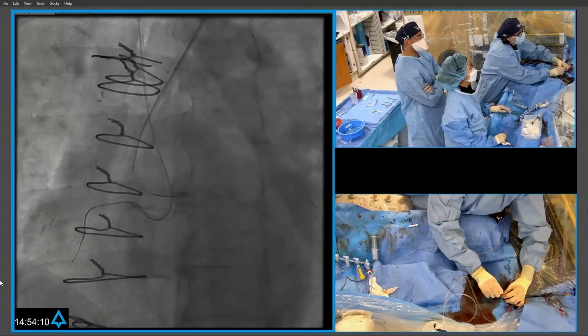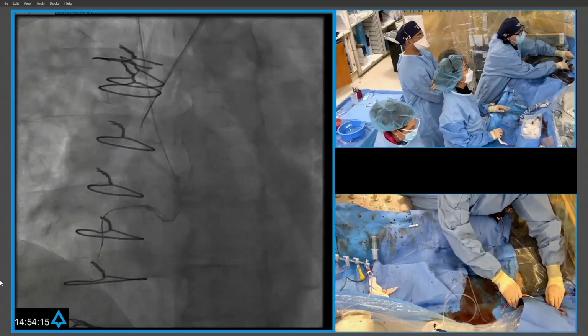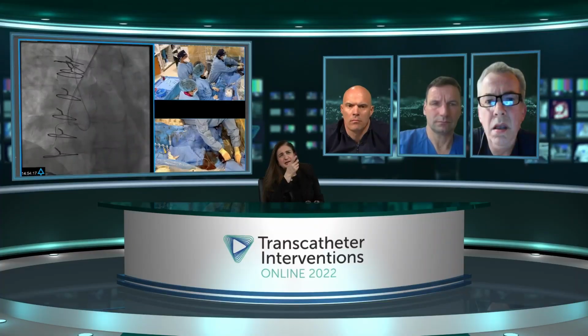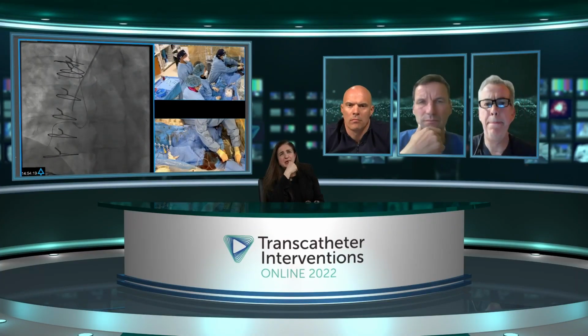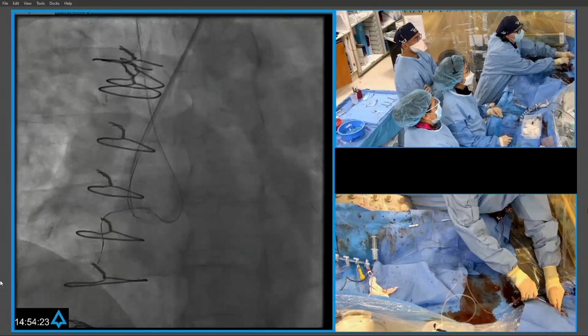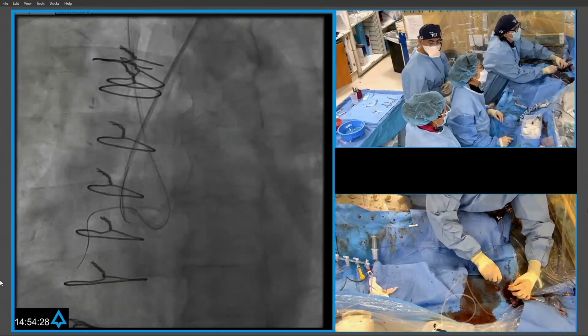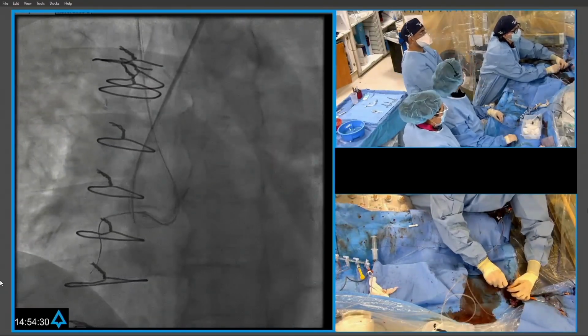So it'll often be 2 femorals and a radial. Yeah, so that's what I was kind of going to ask you. And I just feel like this EBU is a little bit too big. Are you going to maybe just try a smaller one? It's usually from the left arm in the post-bypass patients in a man of this size. Usually it's too small, but we'll go up one size, and if that doesn't work, we'll go down a size.